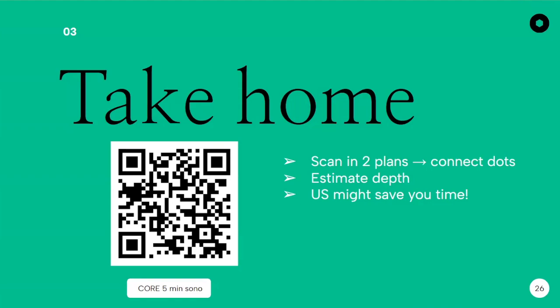As a disclaimer, this procedure is not going to be for everyone. Because you will have patients where you can see every vertebra on them and you know exactly where to go, and it's really easy. But as the obesity epidemic in America expands and more of our patients have more adipose tissue, it can become harder to do these procedures. And so why not use ultrasound if we have the capability?